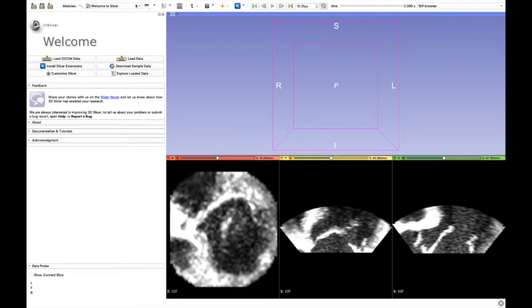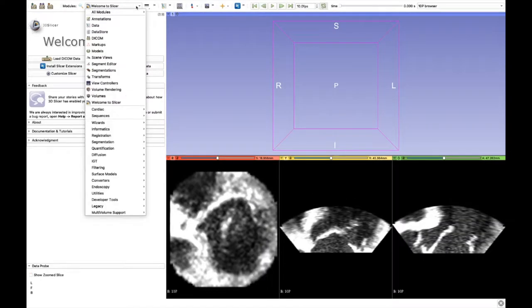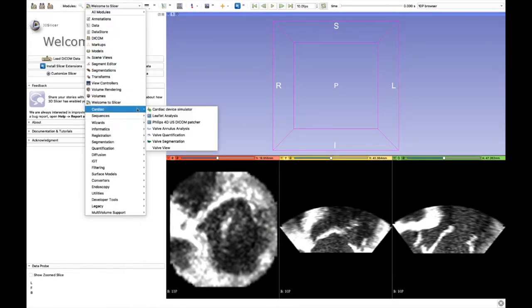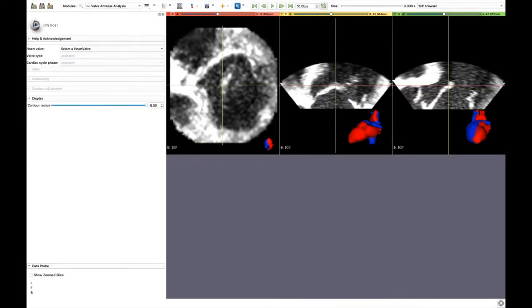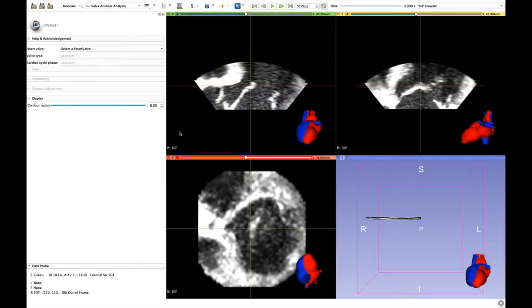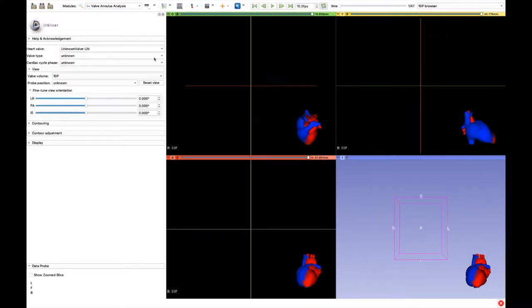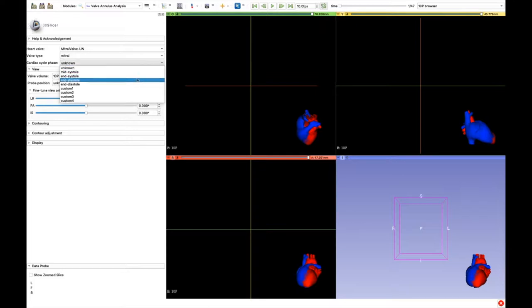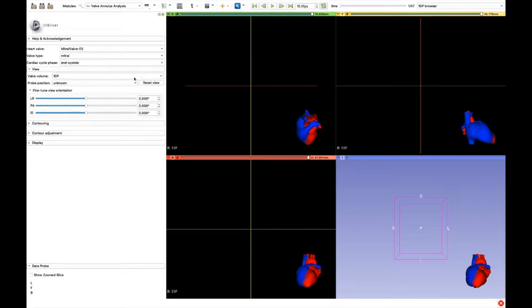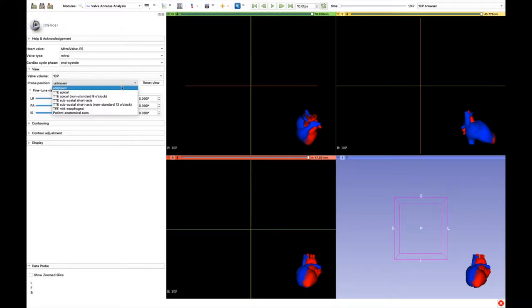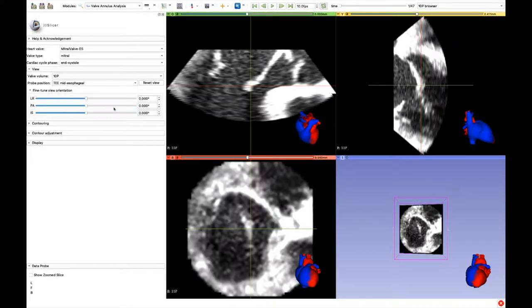Now we can open the valve annulus analysis module. We create a new valve and label it Mitral and systole. Then we select the probe position where the volume was acquired.